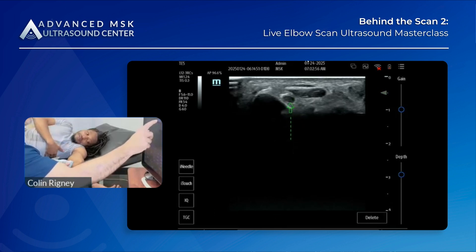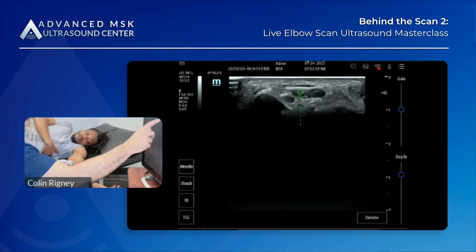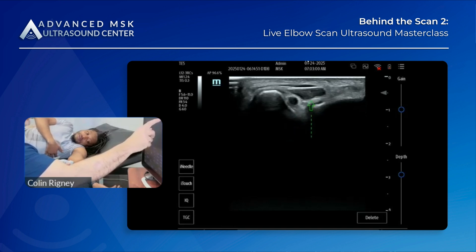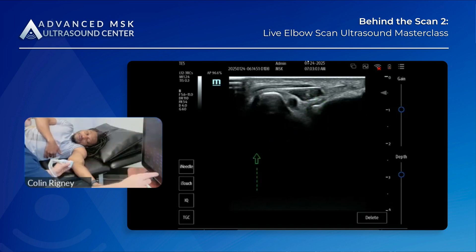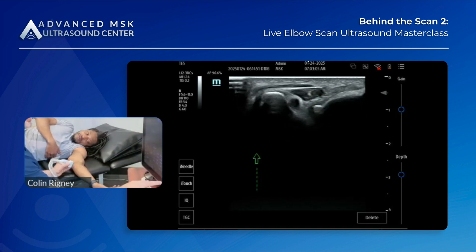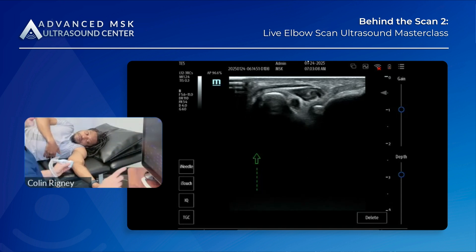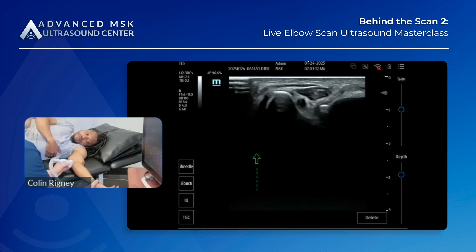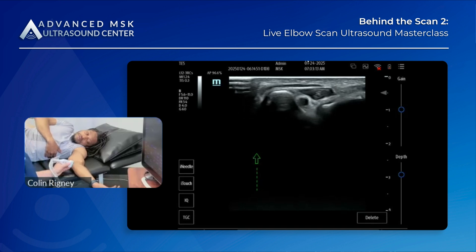This is the ulnar nerve. We have a muscle here — this could be the epitrochlaris or it could be the medial head of the triceps. We're unsure right now; let's get into some dynamics and maybe we'll see.